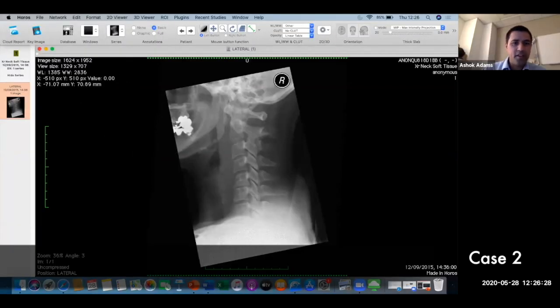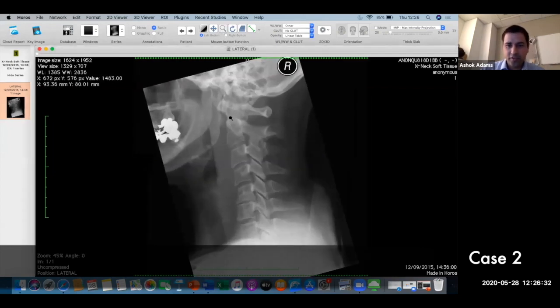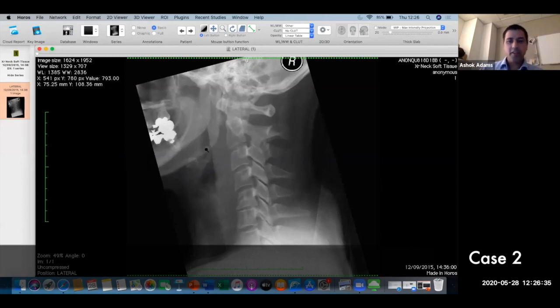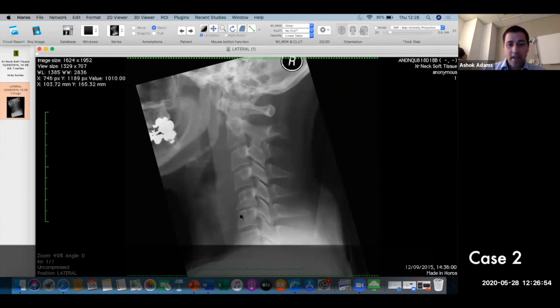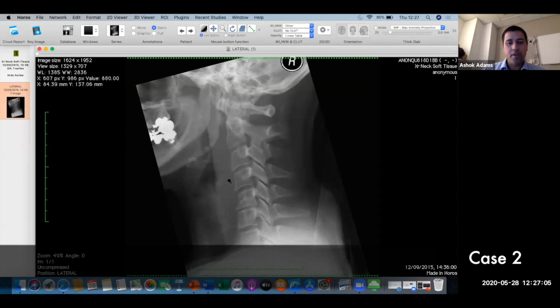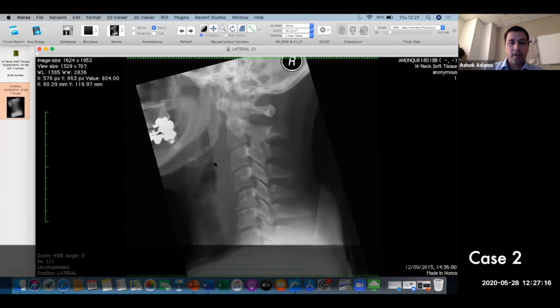Second case - not very common but useful to be aware of. This is a plain X-ray. In East London we have a high Bengali population who love eating fish, so we do many lateral X-rays looking for fish bones. This patient presented with neck pain and elevated CRP. Looking at the pre-vertebral soft tissue: at C3-C4 level it shouldn't measure more than about 7mm; at C4 and below up to 21mm is acceptable. Here you can see it's all filled out and quite thick - abnormal swelling.